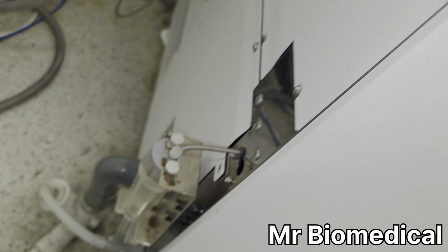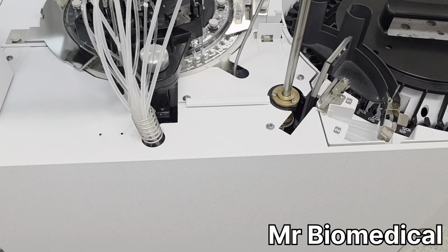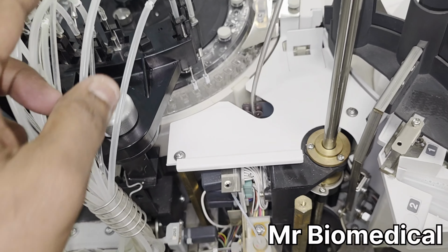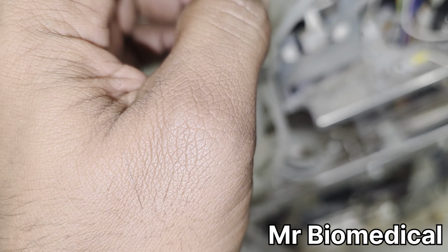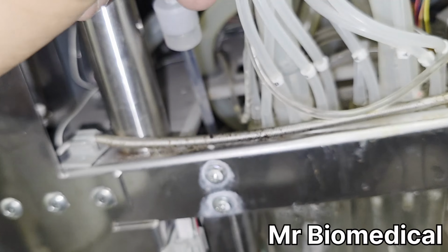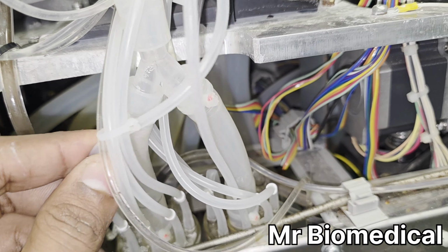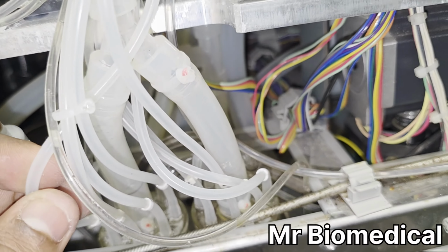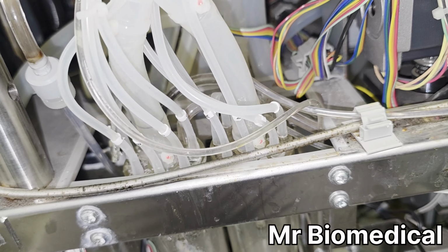So the first step is to remove the screws. And then trace the pipe, which side it is going. It is most important. In this case, I found the probe is the rinse probe, and it is going to the right side. So make sure you are removing the correct one.